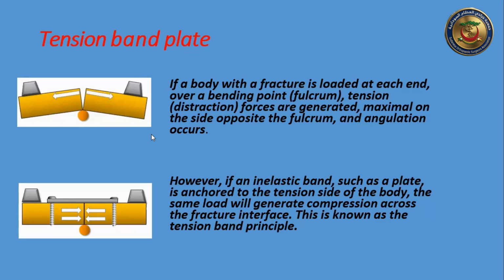I can gain the tension band effect with a plate, and I can gain it with K-wire and band. The idea here is to convert the tensile force to a compression force, so we put it in the distracting area, the tension side, and compress the fracture, transforming this tension function to a compression function.